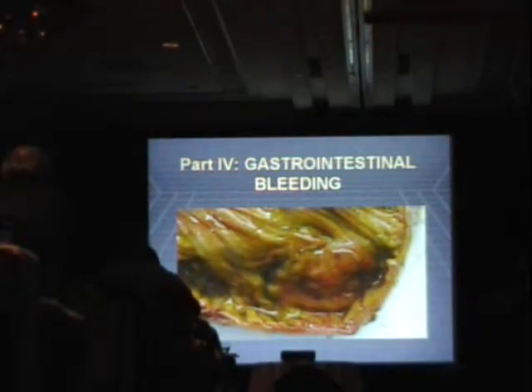So here's an example. This is a normal case here. There was an abnormal one here, which just shows that over time, there's not much clearance of anything out of the stomach. Okay, the next category is GI bleeding.